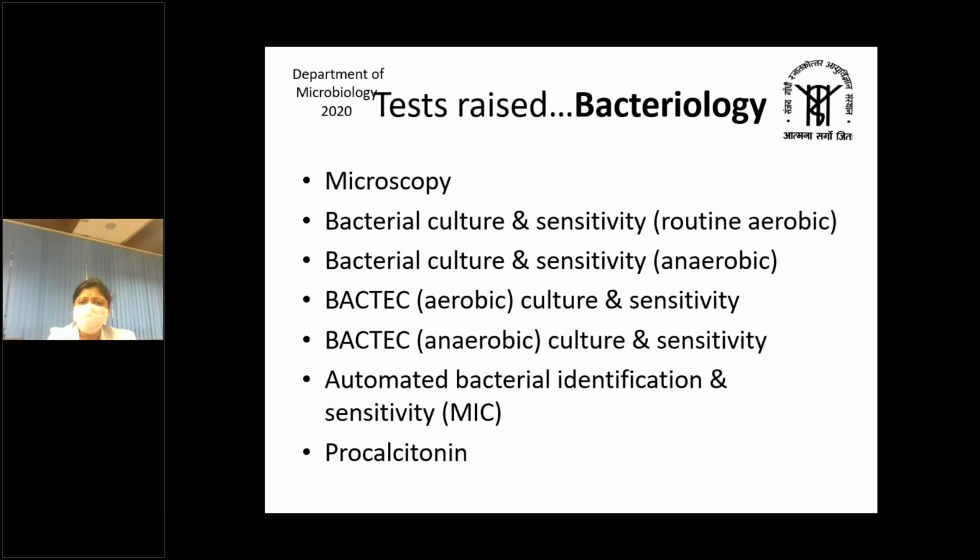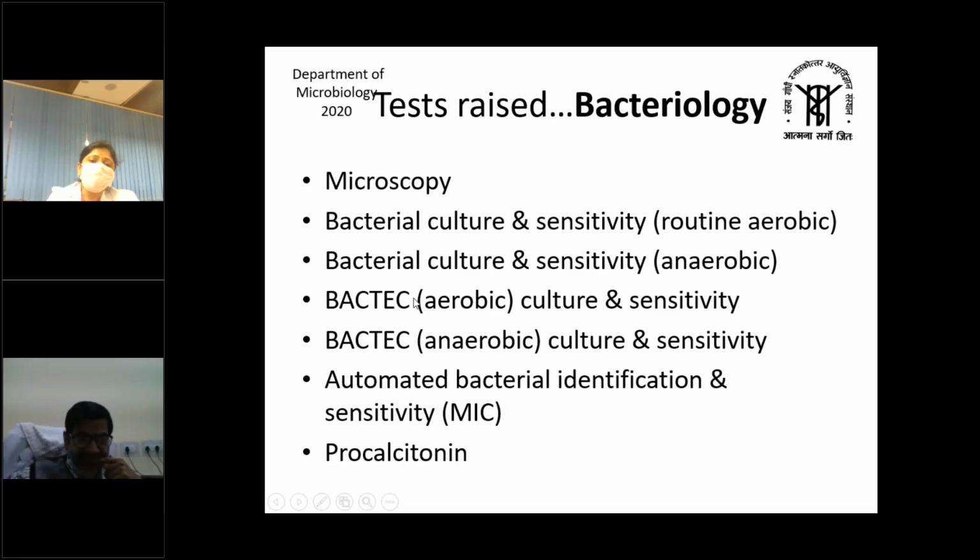Now, I will not go into very much detail about the tests that have to be raised, but by and large, we have to raise microscopy as well as culture. In the bacteriology lab, for blood cultures, you have to remember that we have a set of blood cultures, both aerobic as well as anaerobic, for culture and sensitivity for patients who are in sepsis or bacteremia.